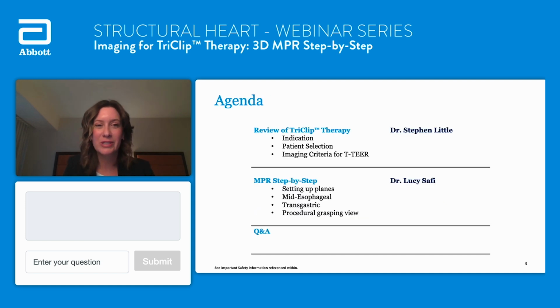Here's our agenda for today's program. First, Dr. Little will do a review of the imaging criteria for TriClip therapy and how to determine what will make for an easier or harder case for implant teams that are just learning the procedure. Then Dr. Safi will take us through a step-by-step of multiplanar reconstruction, a critical skill needed for TriClip cases.